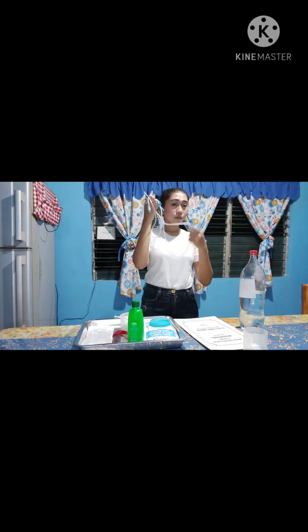After that, we're going to clamp the tubing to reduce the risk of contamination. Then keep the tube right here so that no air goes inside the tube, since it could endanger the patient once air is present in the tube.